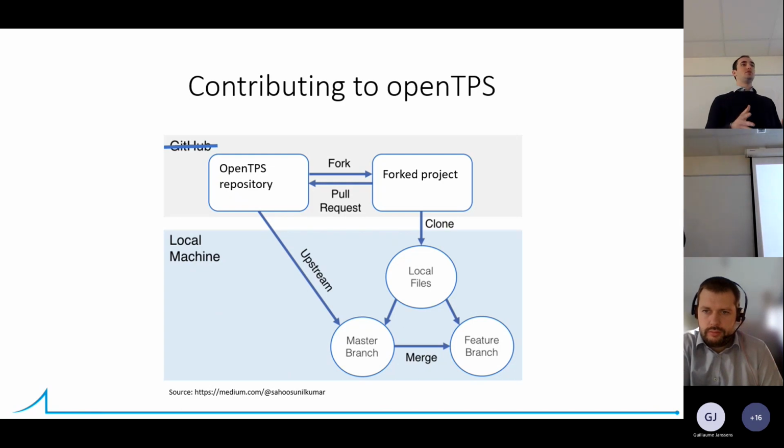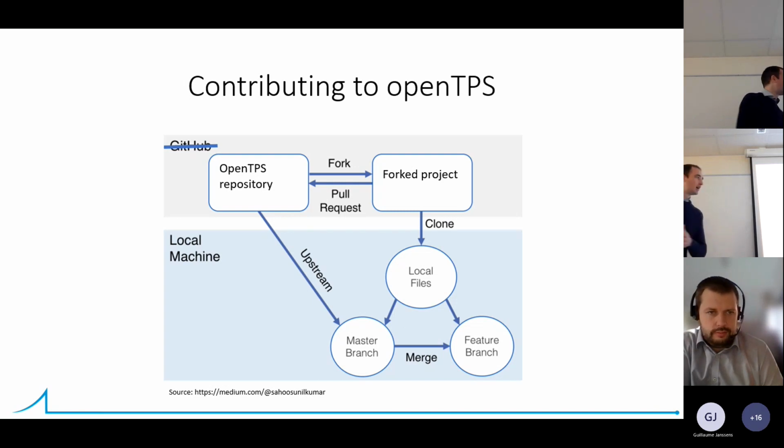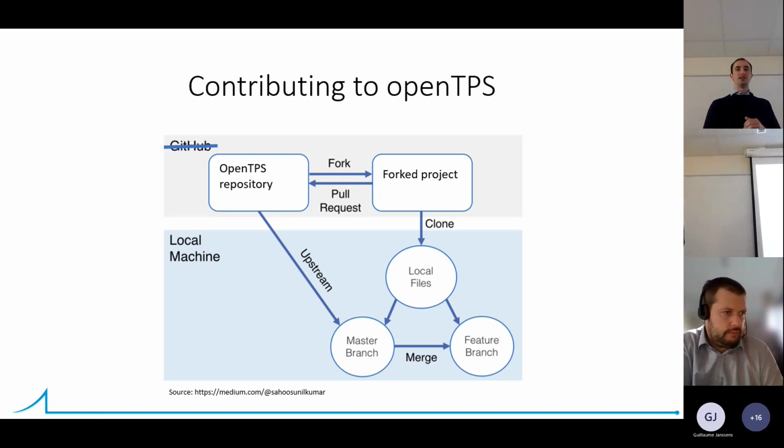If there are any issues related to the installation of OpenTPS, we can have a look, and we can also have a look with you on how to run examples, etc. For people who would like to discuss in more detail whatever we have said today, don't hesitate to send an email, and we can also have a discussion, a meeting later.